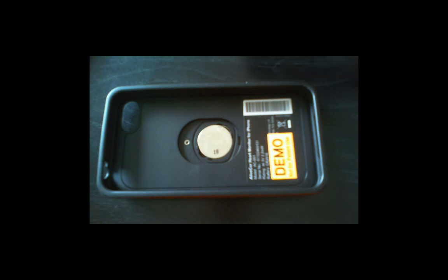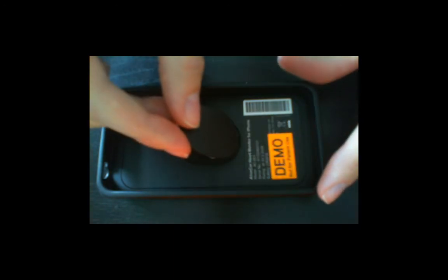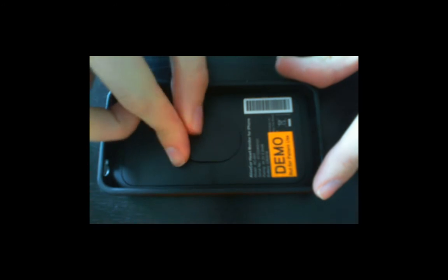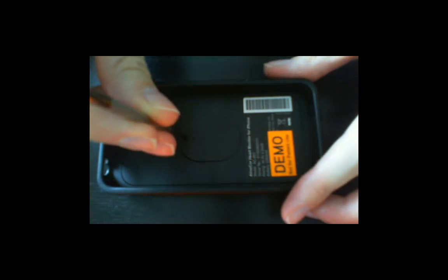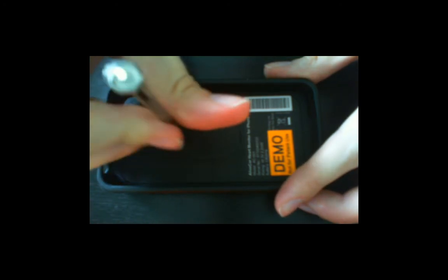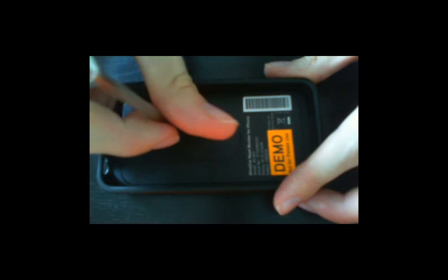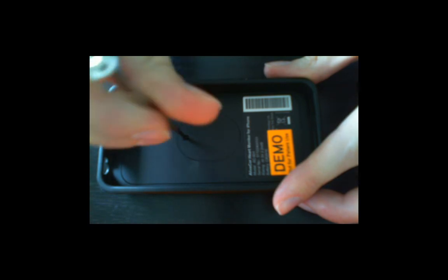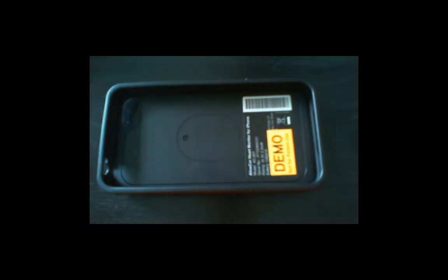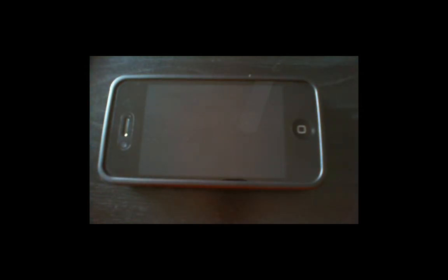Then replace the battery compartment door, starting with the tab on the bottom, and put the screw back into place. You may snap your iPhone back into your veterinary heart monitor, and you are ready to continue recording ECG rhythm data.